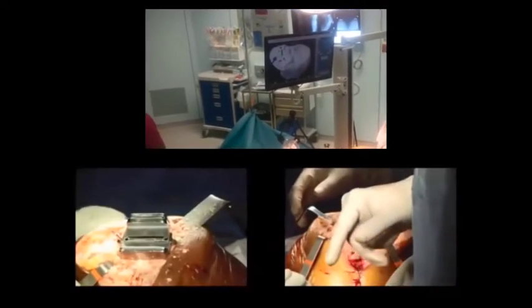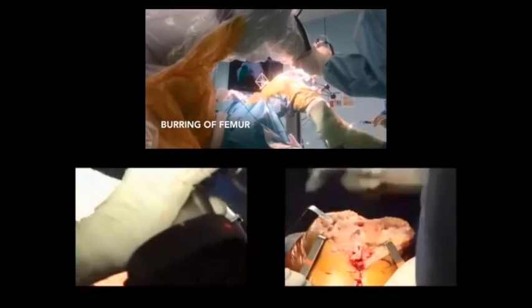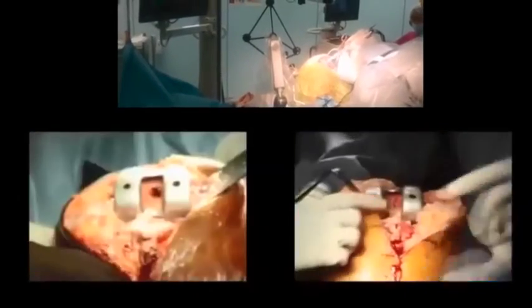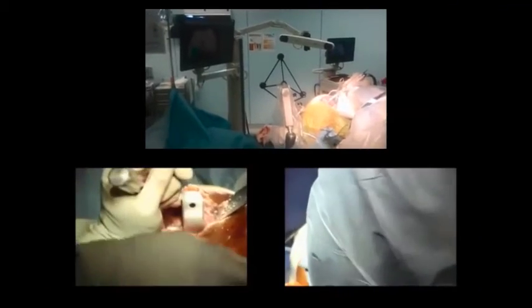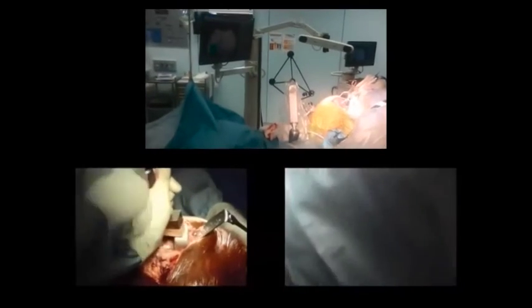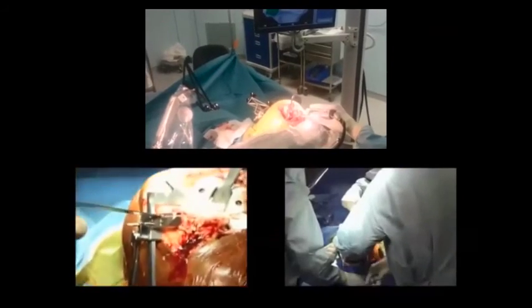It looks like we are completing the cuts on the distal femur as you can see above, and very soon we will be fitting the femoral implants. That's the notch that needs to be cut in the distal femur of the traditional knee replacement below, and then we fit on the implants. Whereas with the Makoplasty above you can see we are really doing more of a gentle burring of the femur to make sure that the implant fits with the patient's bone, cartilage, and ligamentous anatomy.